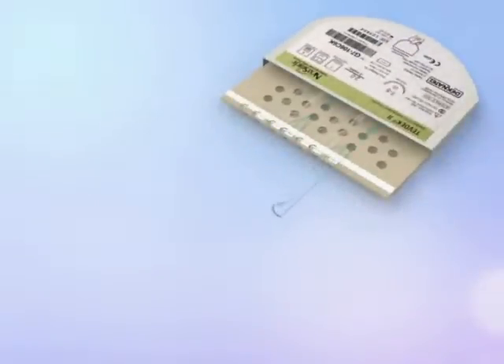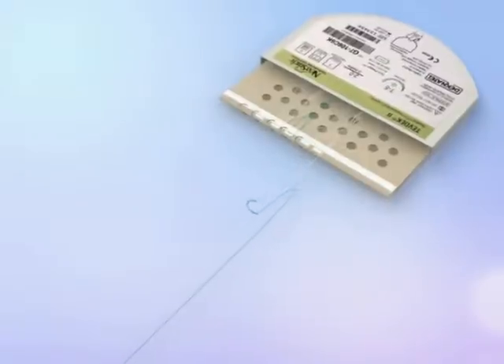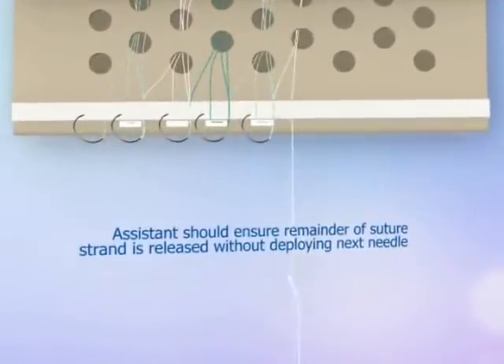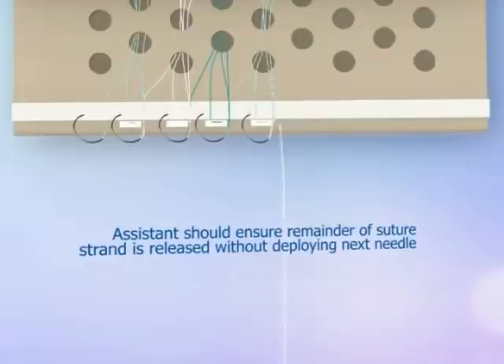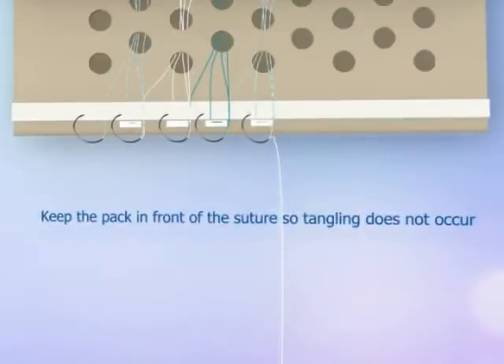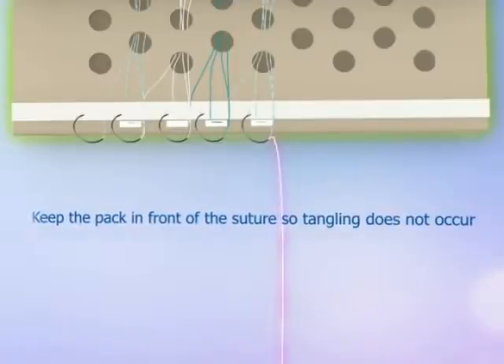Deploy the first suture by arming the single-stranded needle from either the right or left side of the package and release the suture. For pledgeted suture, pull on the suture until the pledget is released. The assistant should ensure the remainder of the suture strand is released without deploying the next needle. When working with Next Stitch, it is essential to keep the pack in front of the suture so tangling does not occur.